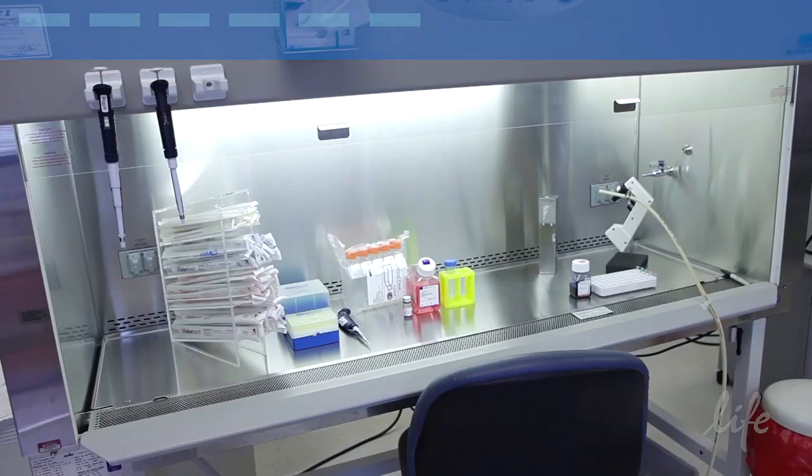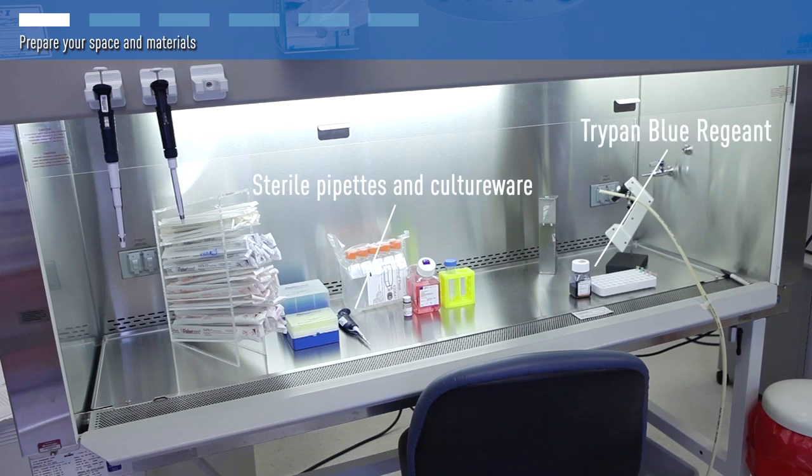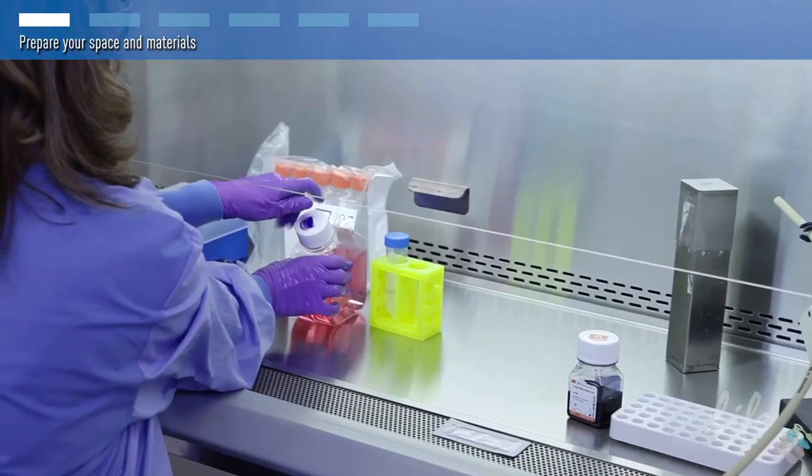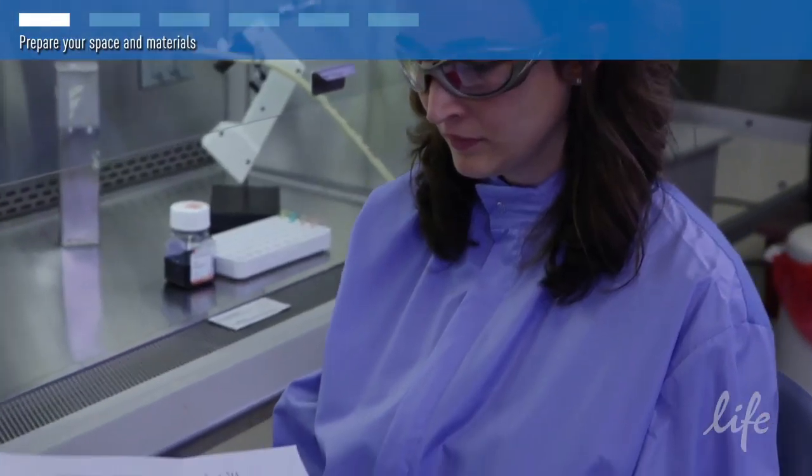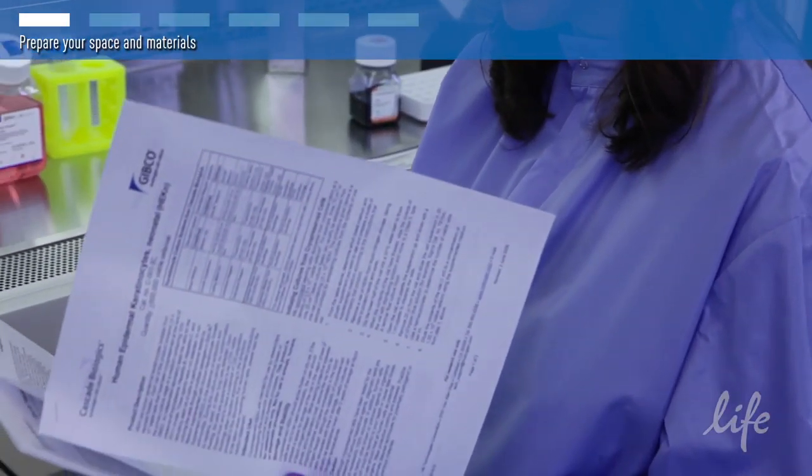Start by prepping your space and materials. You will need a 37°C water bath and standard tissue culture flasks and pipettes. Prepare the basal media and supplements for your particular cells by following the product manual and label and date all medium bottles.